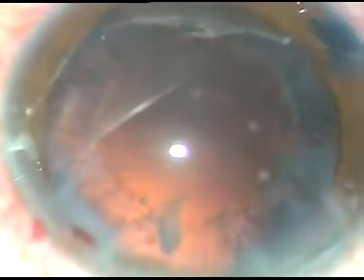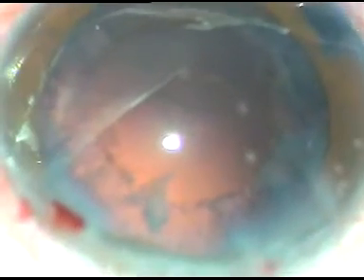At this time, the phaco power is 60, flow rate is 45, and vacuum is 450. So the nucleus has been removed. Now there is a small piece of nucleus at the side port at 1 o'clock, 1:30 o'clock. It has come. Now is the time to remove the cortical matter which is there in the equator of the capsular bag.